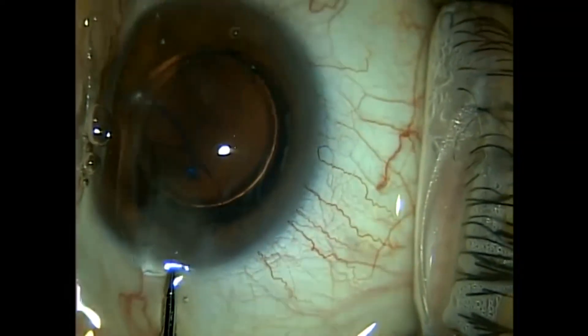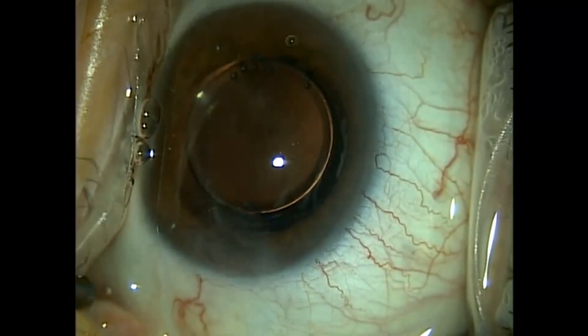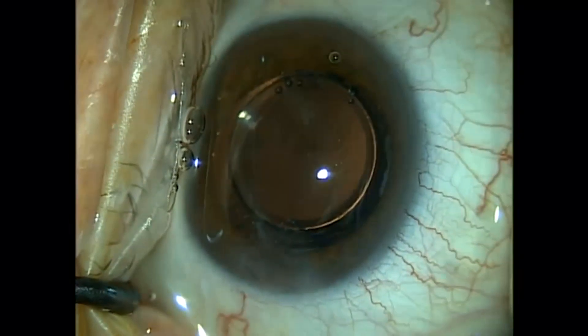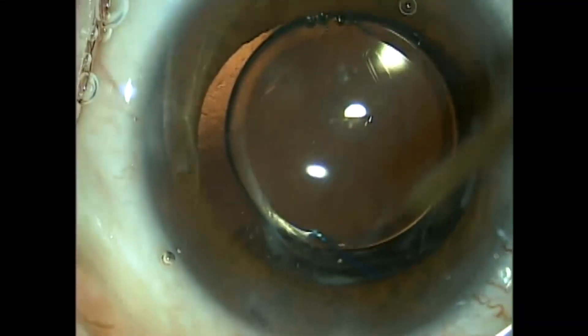I cut the opposite side front and back. At this point, all we have is some vitreous that has presented itself into the incision. You can actually see the white crystals in the vitreous — those are calcium crystals of the asteroid hyalosis this patient has. The calcium deposition to the posterior surface of a silicone implant is extremely rare and has been reported in only some cases.